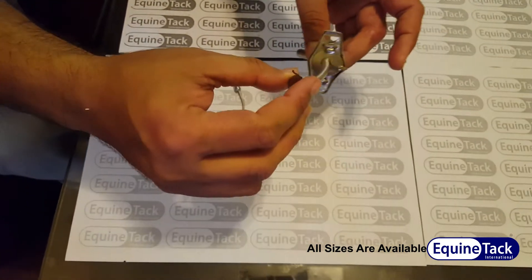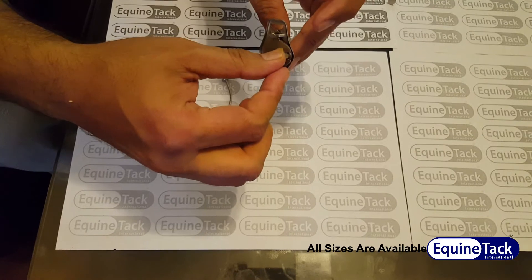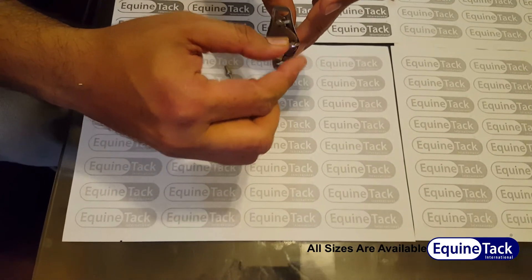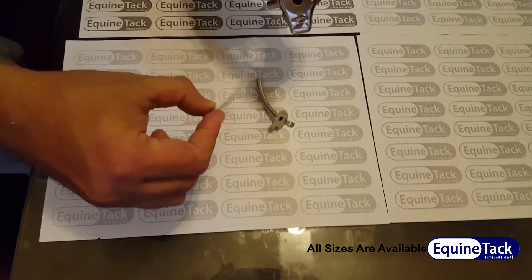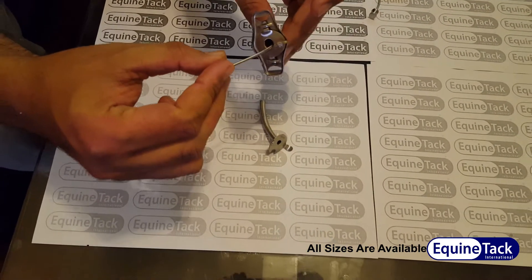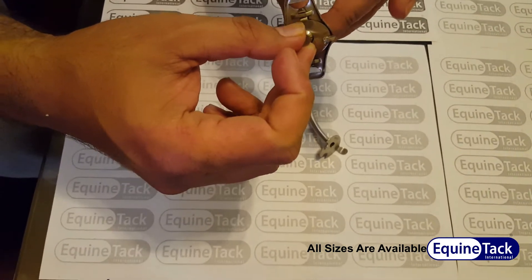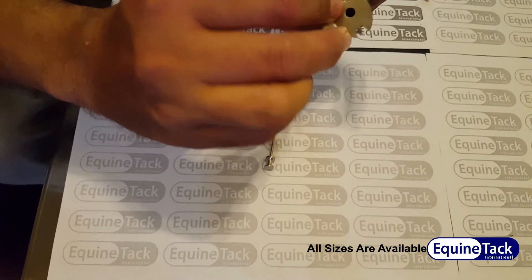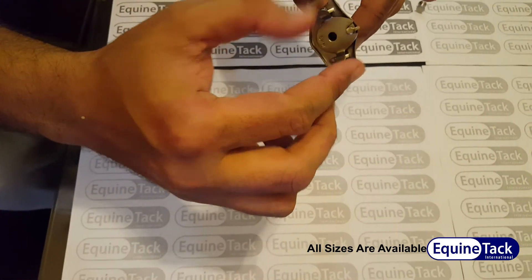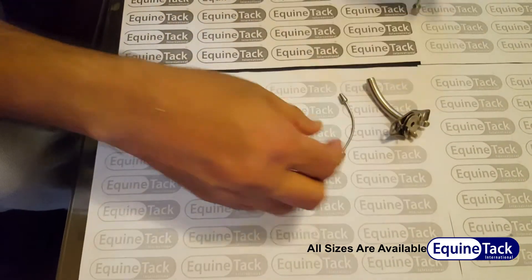This is the inner cannula, as you can see. Here is the lock, and when we unlock it, it removes. We use this obturator to remove the blockage, as you can see — this is the inner side cannula.